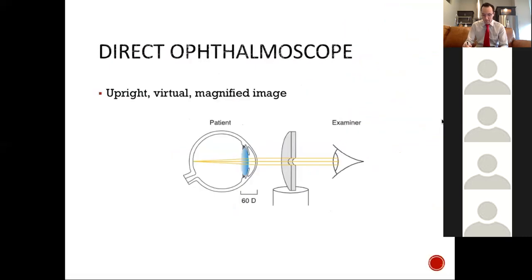So now let's go ahead and review direct ophthalmoscopy, okay? This is another little tool that probably collects dust, but conceptually, we spend a decent amount of time within the book, so I think it's important to know this for our board exam. So we know off the bat with our direct ophthalmoscope, it provides us a field of view of about 7 degrees, okay? And the magnification it gives us is about 15x, okay?